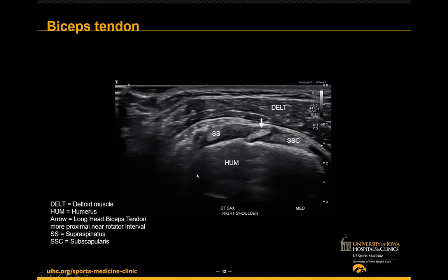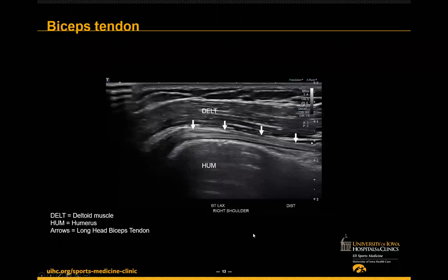Here we can see the subscapularis and supraspinatus, and we're already starting to see some interesting stuff. My pearl here: don't get too excited. We already know this will be the area to look at, so I save it for last to make sure I get through all the rest of my imaging. I do the same protocol every time so I don't forget to do something while getting excited about pathology. Next we'll move to a long axis view — always try to get orthogonal views of all structures.